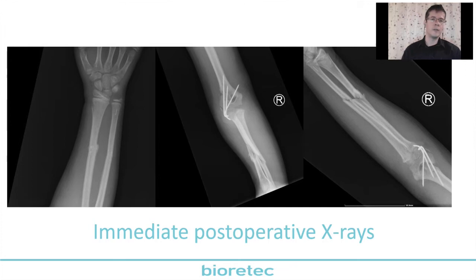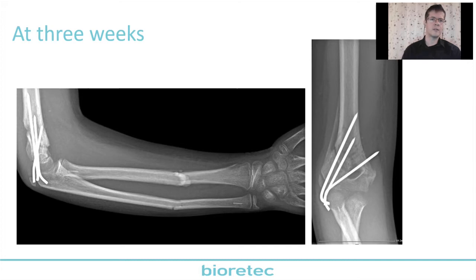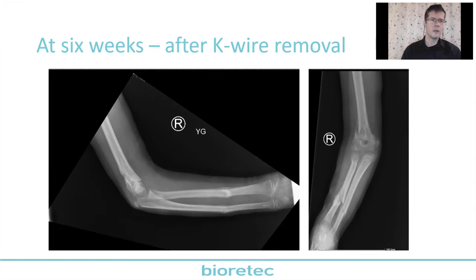After a few weeks, the immediate X-rays. Next slide, please. After 3 weeks, there is a callus formation around the elbow and callus formation around the forearm. Next slide. Here we can see the callus formation. Next slide. And after 6 weeks, we removed the K-wires in an outpatient way. And next slide, please. And we can see her function now.